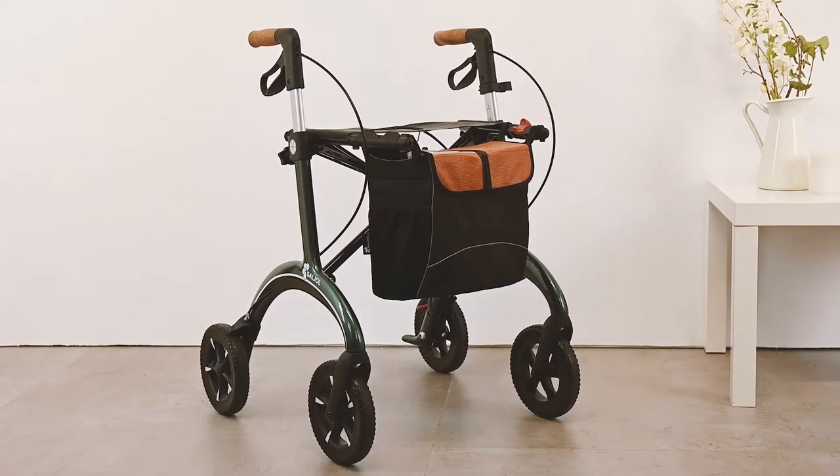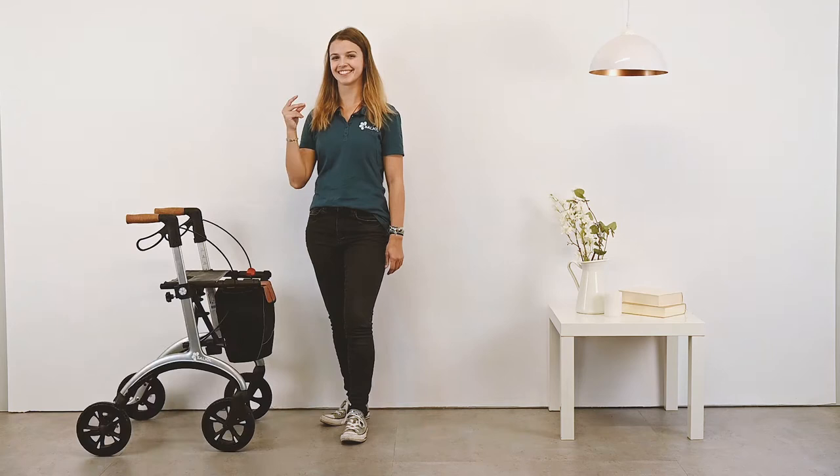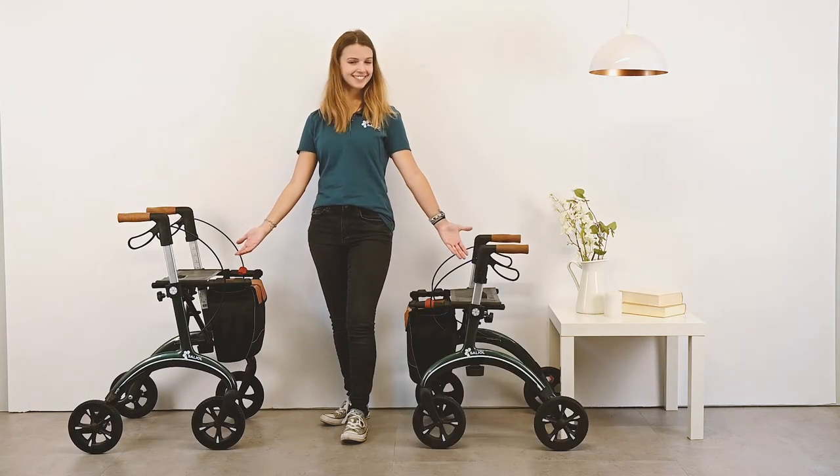A noble and high quality design in the style of the 50s. It's available in three stylish colors and seat heights of 62 and 54 cm.